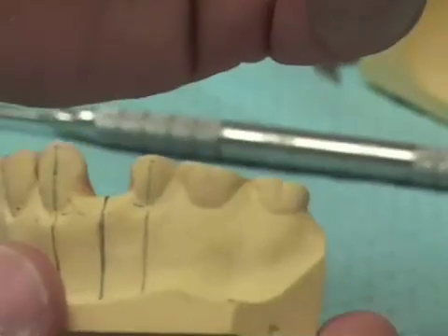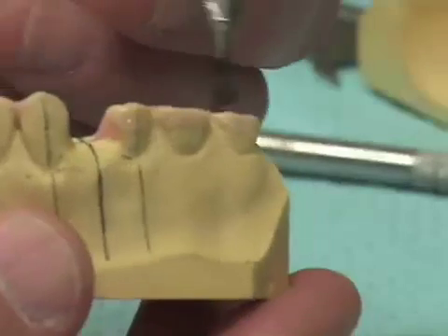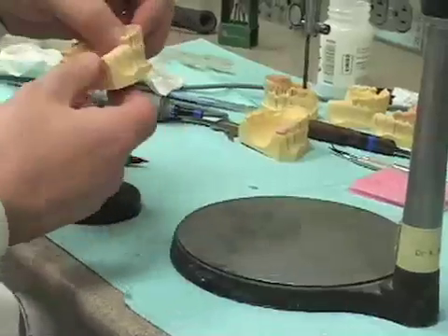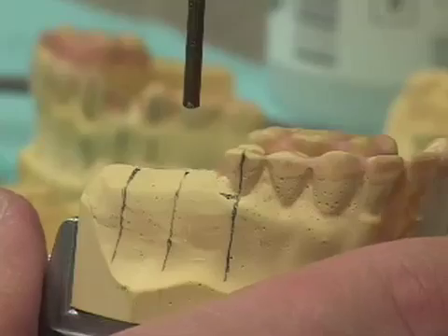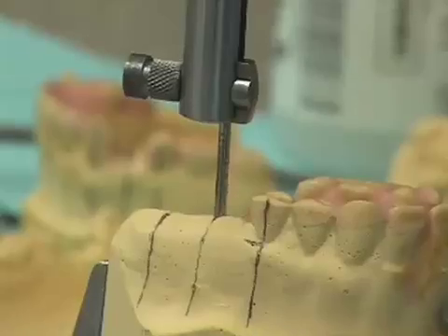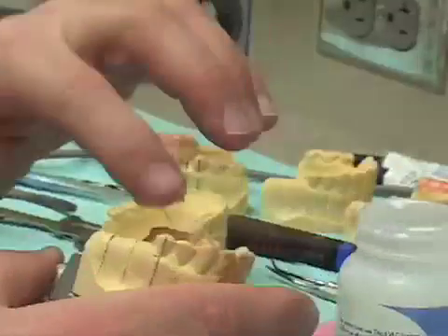We've got our blockout pretty well complete. What we'll do next is proceed to adapt our triad material for the fabrication of our x-ray guide. At this point I could replace the cast in the surveyor table, lining up those little lines I had on the back of the cast to make sure it's oriented the same way. I now remove the 2.8 millimeter drill and place instead the 2.0 millimeter drill blank, which can then be oriented exactly right over the small depression I placed in the cast earlier. I'll bring in a sheet of triad material and place some lubrication on the cast.